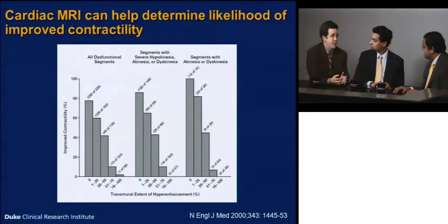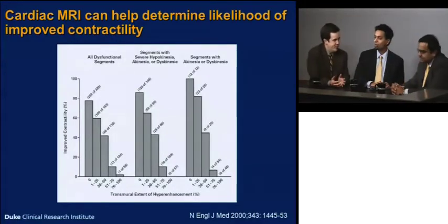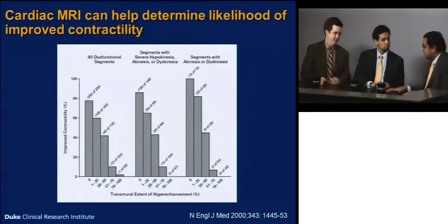And you could change a few things about this patient's profile. Yeah, absolutely. Make the patient 10 years younger and say, well, is coronary disease really the cause here? You can see cardiomyopathies, infiltrative cardiac disease that will give you wall motion abnormalities or other things, and you could see the same thing. And so MRI has been helpful in terms of understanding whether there are other causes that we can be surprised by. Yeah, it's clearly biased, but if you're looking at the muscle, it's muscle technology, so it gives you some more information.